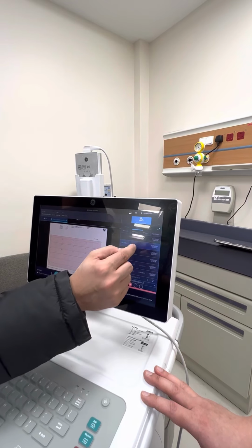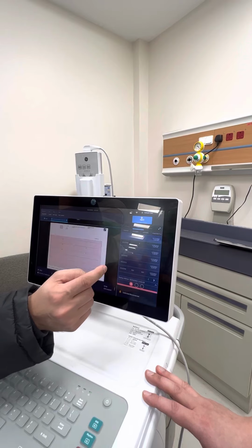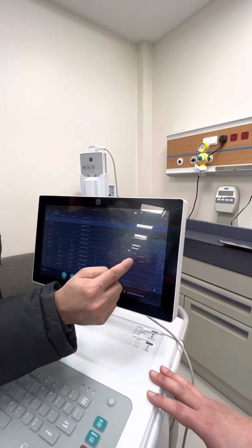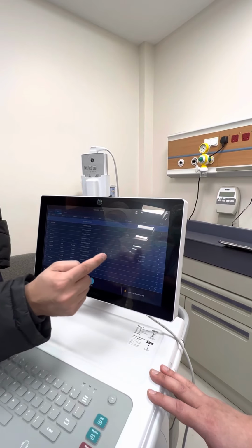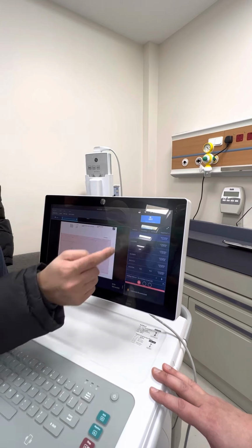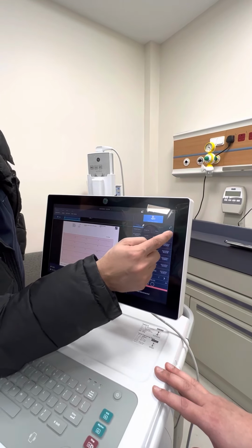Who has not been transmitted yet? Exactly, so I think this is the one. Then attach. Double check the attach option. Yes, this one was not transmitted. So we'll attach one order to it. We'll go to the orders. This is the 12th February.